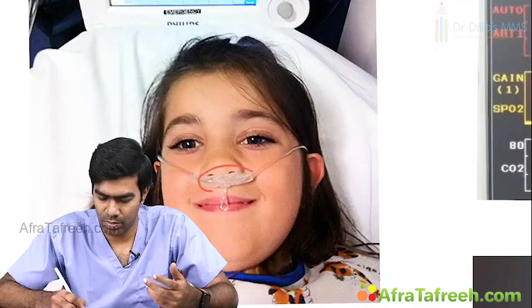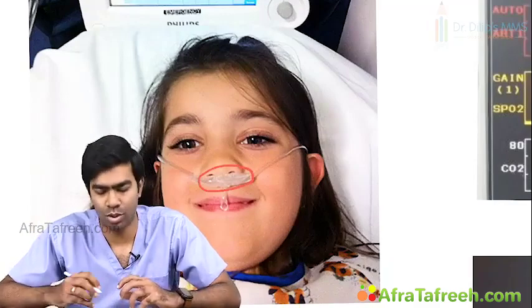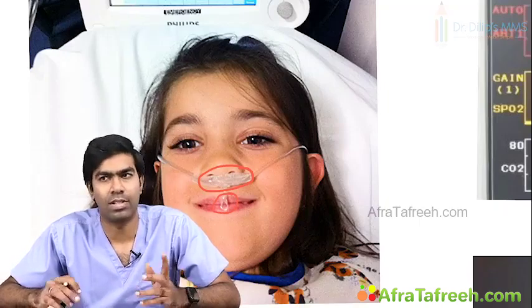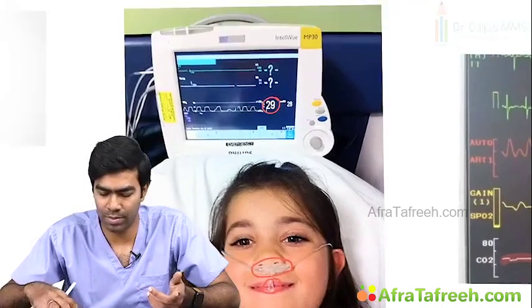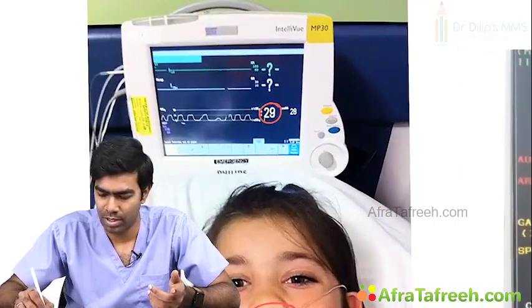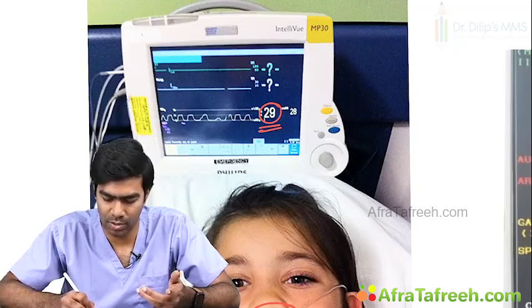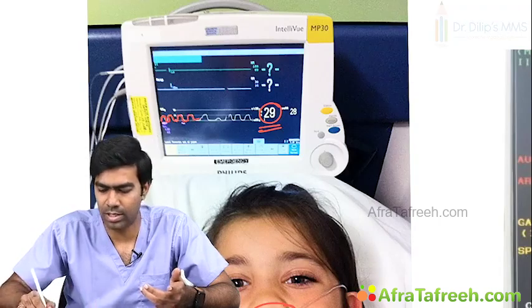So this is one kind of detector that is in the nose, and you can see a pendant-like structure that is also detecting the carbon dioxide. These are external detectors. So a lot of types of detectors are available. You can also see that the patient is having an EtCO2 of 29, and you can see good little waveforms here also. Clear? These are the EtCO2 waveforms.